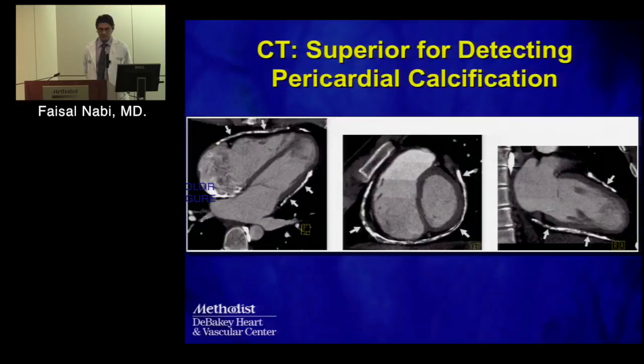You have two options. You can do a TEE, where you might make a diagnosis. You might still struggle a little bit even with the TEE. Or you could take the patient to a scanner and do a quickie non-contrast picture. Which one, if you're rounding, would you choose? I would choose the non-contrast CT for the reasons you said.